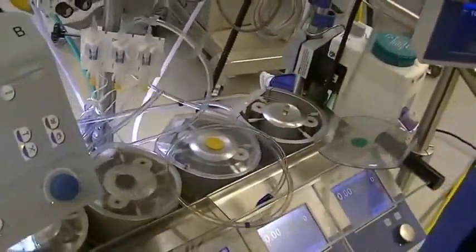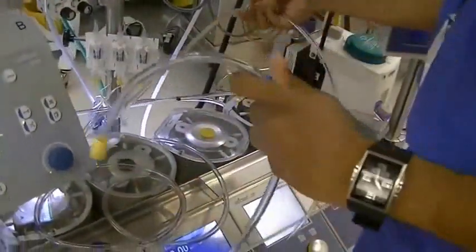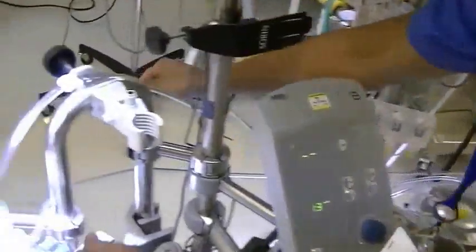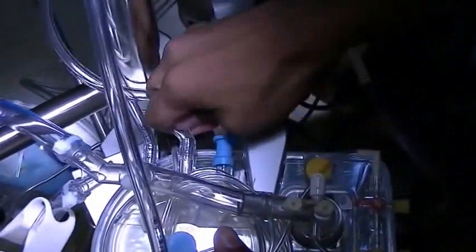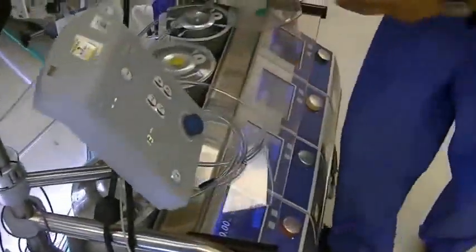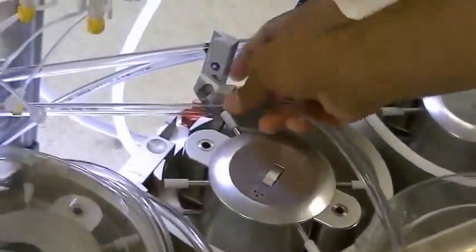Now the yellow is most often used as either an LV vent or a sump. Same thing with that — go around everything. Again, confirm the direction.